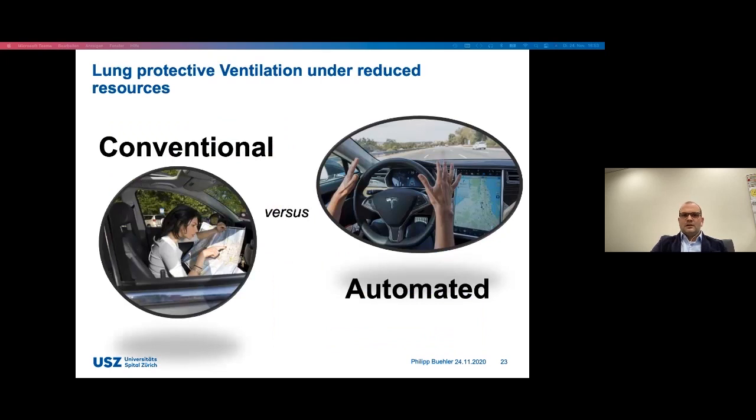ventilation modes. A specific consideration was the high number of patients, with intensive care units worldwide overburdened, resulting in a lack of resources and expertise. Our thesis was that closed loop ventilation, as a fully automated and optimized ventilation mode, could be associated with a higher degree of lung protective ventilation while reducing the number of manual mechanical ventilator setting adjustments in the ICU during the COVID-19 pandemic.